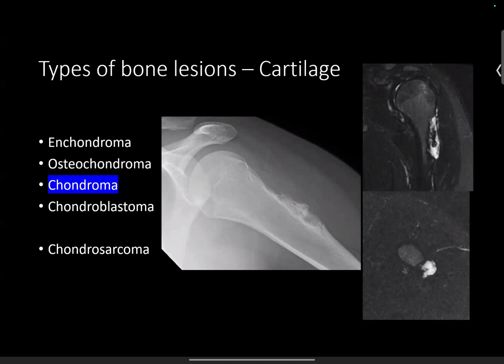We see it all the time in rib lesions when children come with bony bumps. You do an ultrasound and you see the rib come up, and you see a little hypoechoic cap, very smooth, and you can actually measure the cap. You have to be looking very carefully for it. So you can do ultrasound, yes. The problem is if it's very deep, you wouldn't be able to see it. Right.